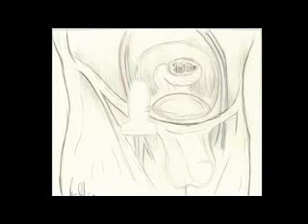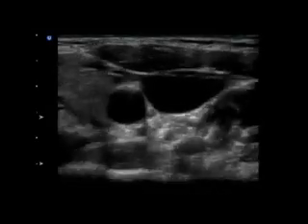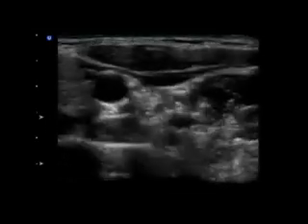The femoral vein is also a good location for ultrasound-guided central line placement. The femoral vein is identified by placing the probe just below the inguinal ligament with the marker dot toward the patient's right, so that the patient's right side is on the left side of the monitor and the patient's left side is on the right side of the monitor. Conventional teaching is that the femoral vein is medial to the artery. However, in more than 50% of patients, the vein and artery are overlapping. If the artery completely overlaps the vein, it is best to go to the contralateral side or slide the probe distally to find a point where the artery and vein are side by side. The vein is identified using compression, and either the transverse or longitudinal approach can be used.